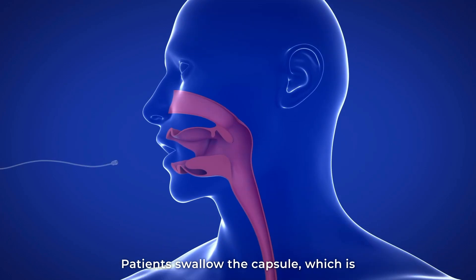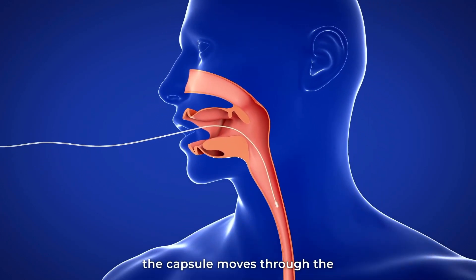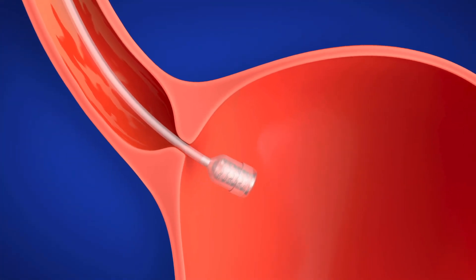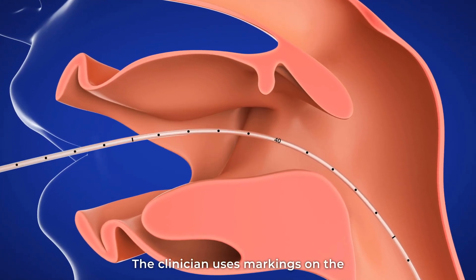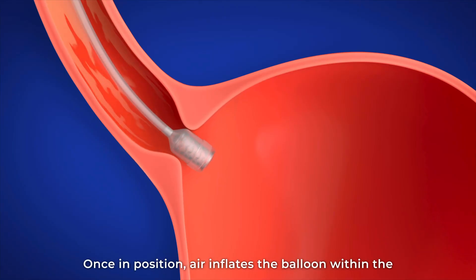Patients swallow the capsule, which is attached to a thin catheter. The capsule moves through the esophagus into the stomach. The clinician uses markings on the catheter to confirm correct placement.